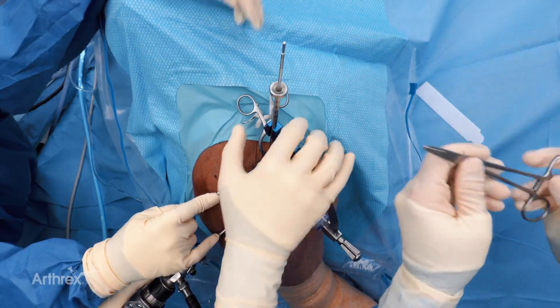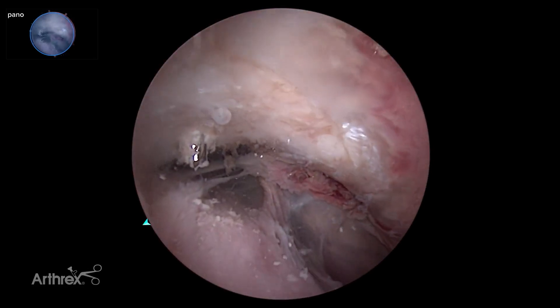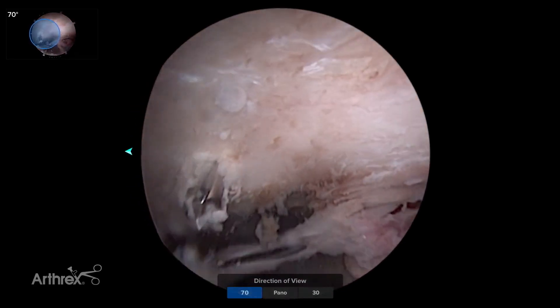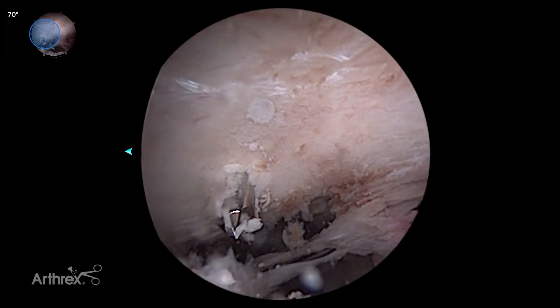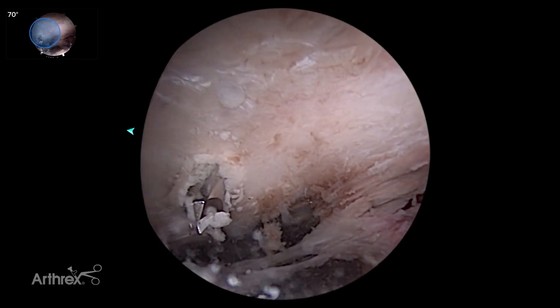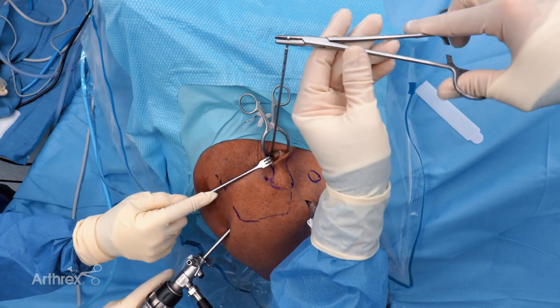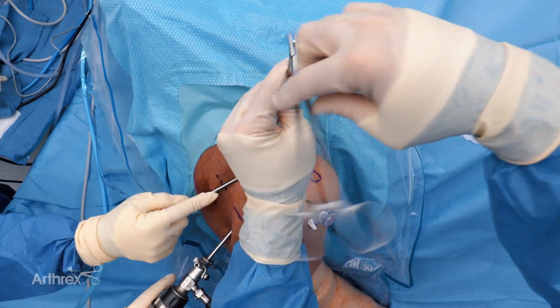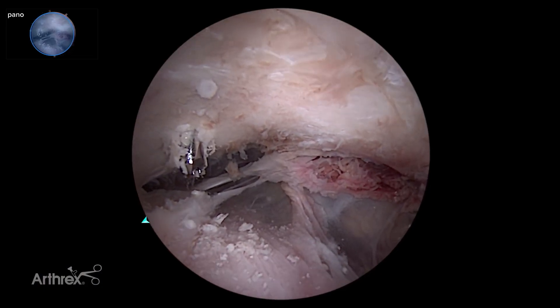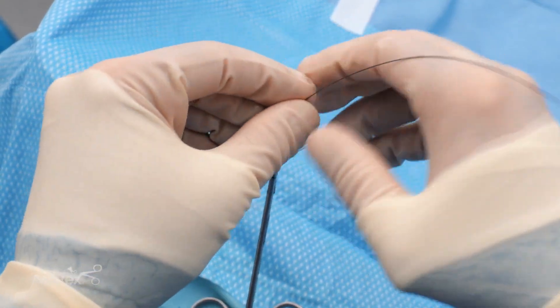You can remove the guide and take another view to make sure you're happy with where you are. We're going to scroll through our 70-degree view — you can really come underneath it and see the orientation and location, confirming a center-center position on the base of the coracoid. We'll take the cannulation out of the drill bit. There's sometimes a little bone at the end of the drill bit, so you want to spin it and clear that so your wire can pass without any impedance, because sometimes it can get hitched up below with a little bone fragment.